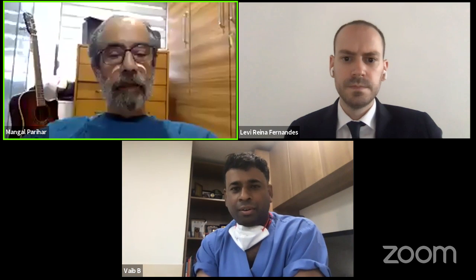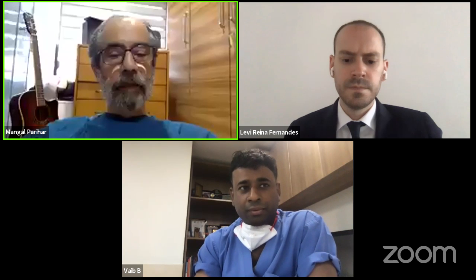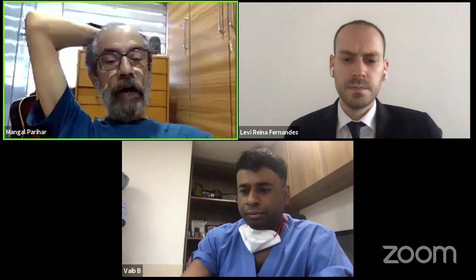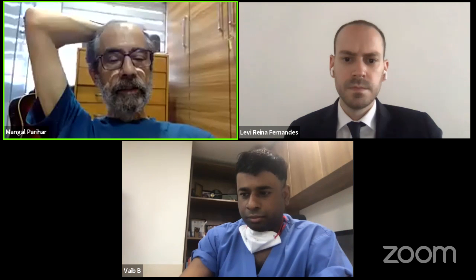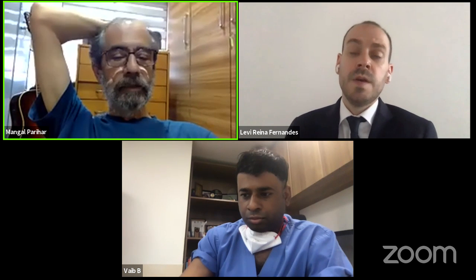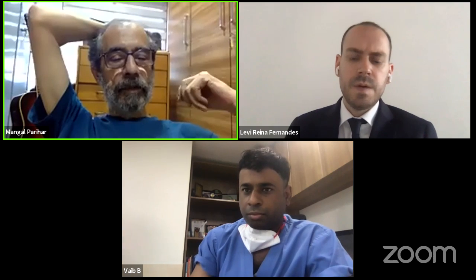So what that basically means is I'm not sure where my mistake is coming in from. It's from surgical technique. But once you say you have your cases, and more people are looking at this now, then we get the numbers and we can find out exactly how much we need to factor in the joint line convergence angle. I'm sure you need to factor it in, no question about that. So I think that's a good aspect of the software.